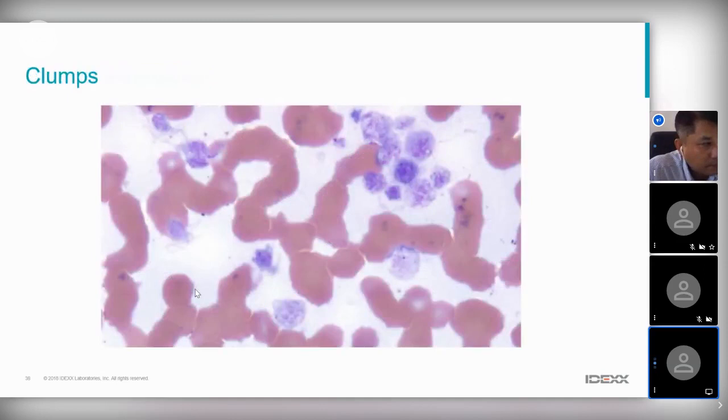Okay, thank you, Professor Tan. So next we see on the microscopic film of the clump, you see these images, the cells overlapped over one or the other, these dots here. Unfortunately, this clump often happens in the blood tube, especially in cats, where we found it 70% of the time. And this makes the automated count lower.